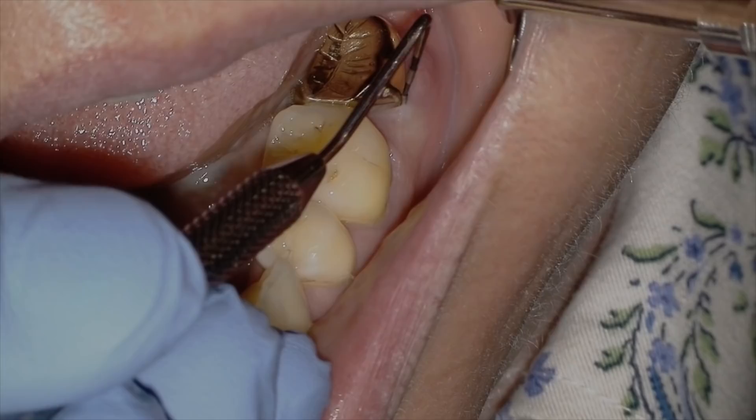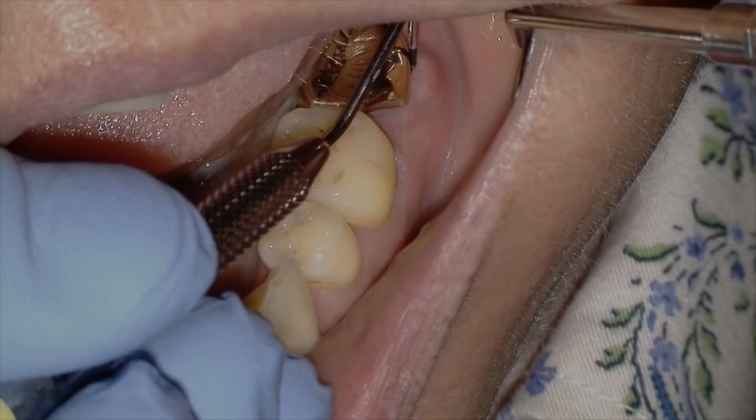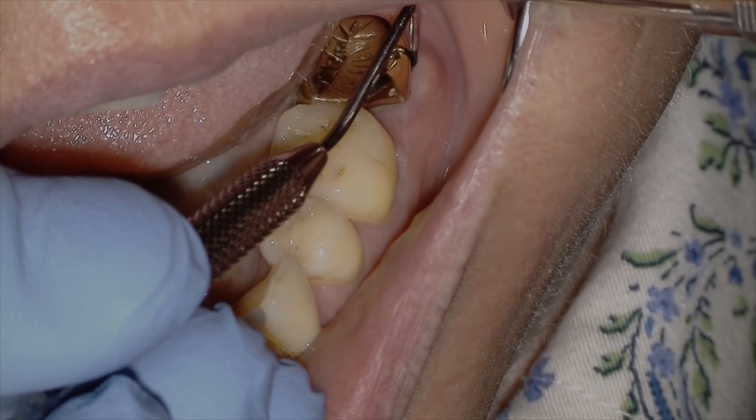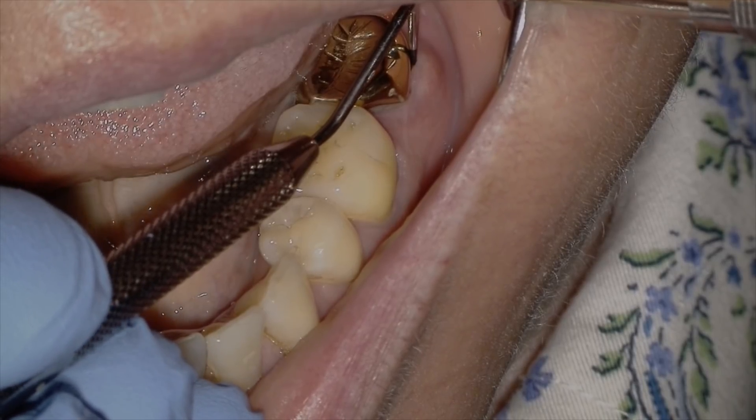Let's take a look at the top three tips before starting cases like these. First: check probing depths. This is a critical step that can help prevent you from starting treatment, as in cases with a fractured root. This case had a single deep probing depth and the patient was informed that the prognosis is significantly reduced for saving this tooth. Second: if you suspect a cracked tooth, transilluminate it with the fiber optic end of the handpiece. A cracked tooth will not permit the light to go past the crack, but if the tooth doesn't have a crack, the light will shine right through.